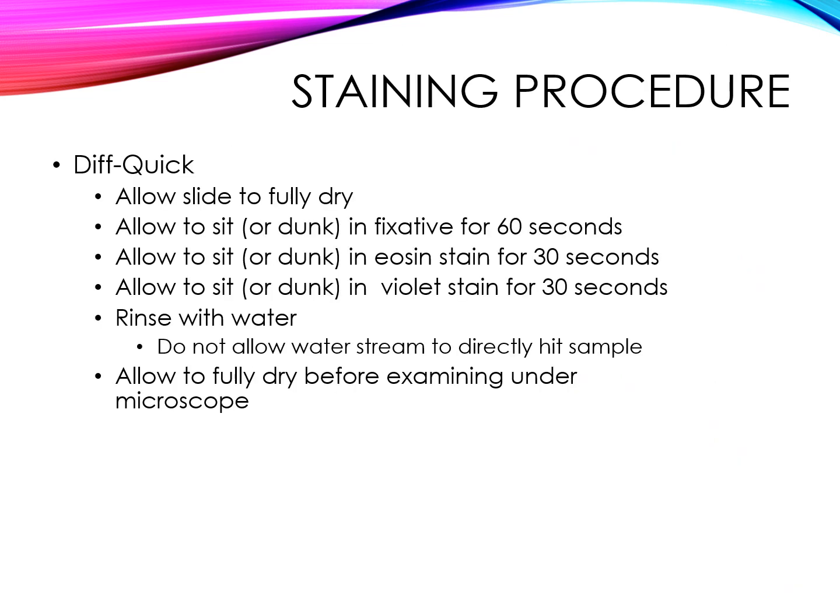Okay, so when you're staining with DiffQuick, there's a procedure that we follow. Remember, when you make blood smears, you should always try to make two if you have enough blood, just in case one of them gets ruined during the staining process. And always make sure that the slide is dry before you attempt to stain it, because otherwise the cells may rinse off during the staining or rinsing.